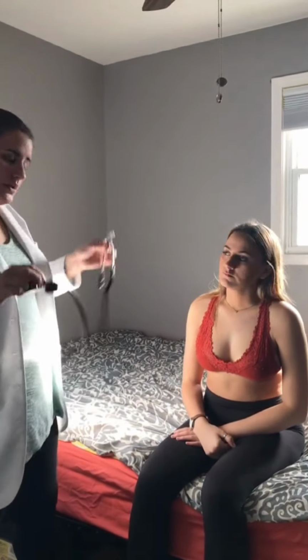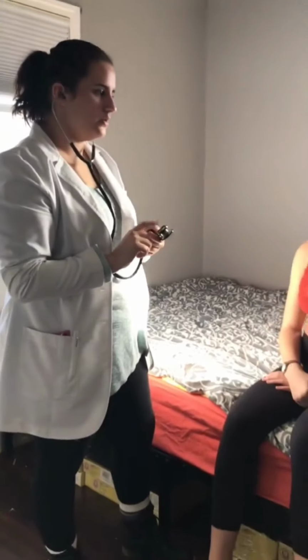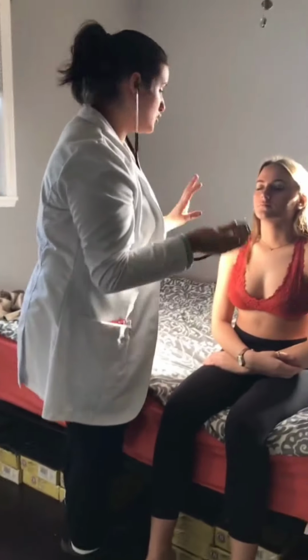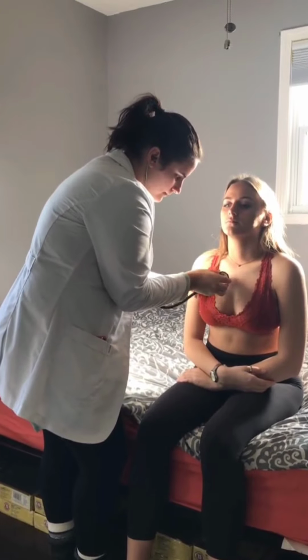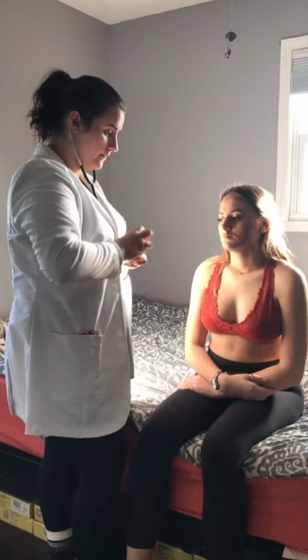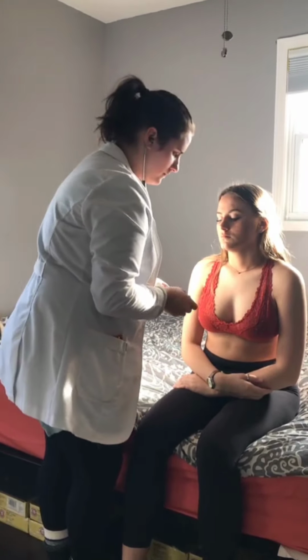And then we're also gonna make sure that it coincides with the carotid arteries. With this, we're gonna wanna listen with the bell, just to make sure that we can't hear any murmurs. And then you can just breathe normally, okay? Well, this little tag is gonna get in our way. Okay.